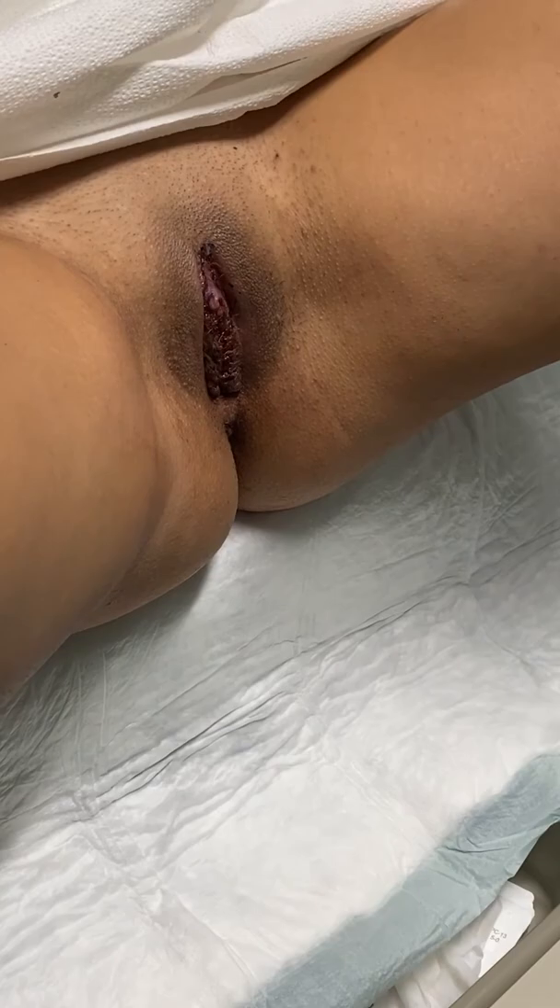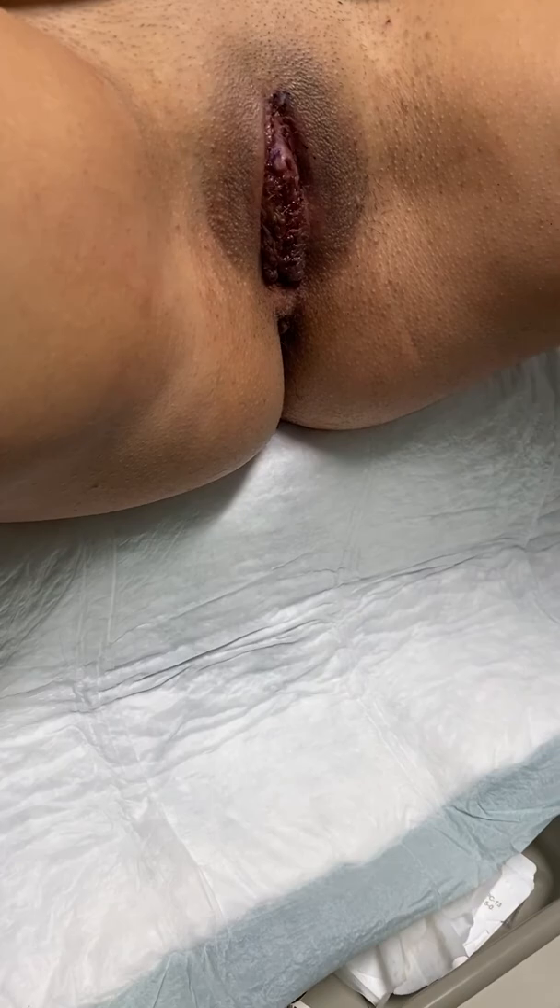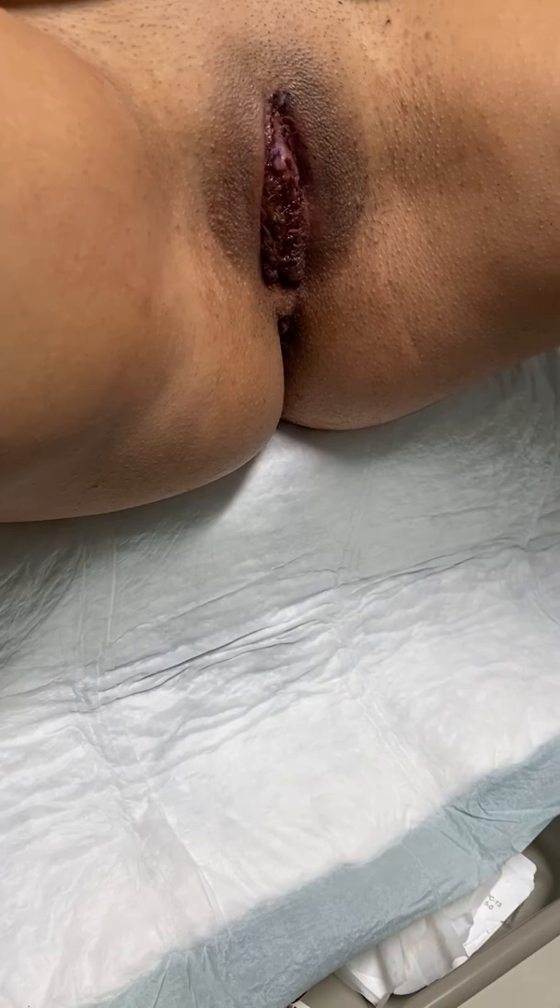All right, you guys. So we completed our labiaplasty and clitoral hood. We did it in about an hour and 15 minutes, purely under local. The patient reported the pain was fine. Look how beautiful it looks — we've got a symmetrical hood with symmetrical labias. They're nice and flushed against the vulva so they're not going to protrude anymore and bother her. Overall it's going to be a really beautiful look.